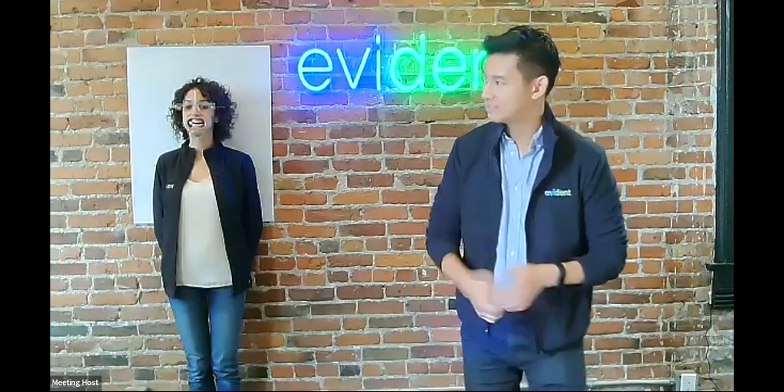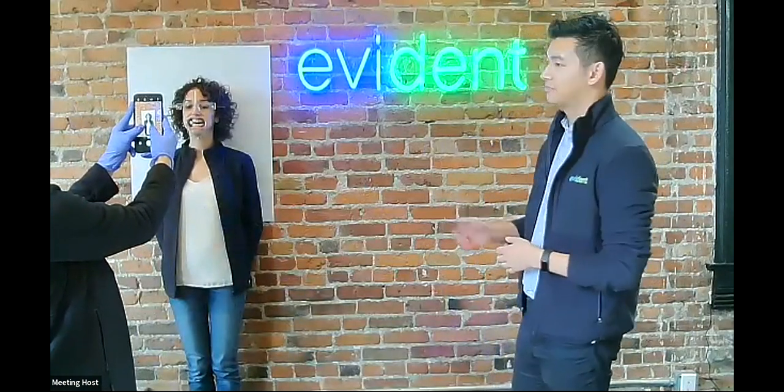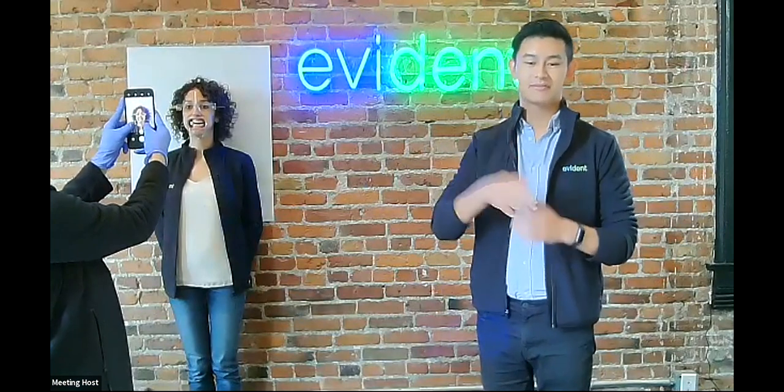So what I'm going to do here is I'm going to pass Nikki my phone. And what you want to do is line up your camera or smartphone just about 3 to 5 feet away from the patient. For you photographers out there, if you enable a 3x3 grid setting on your camera, it's a good reference point when you're taking your photos.